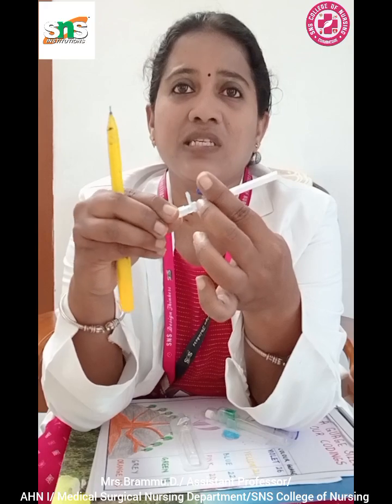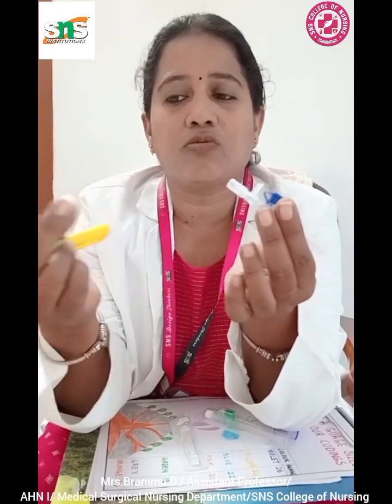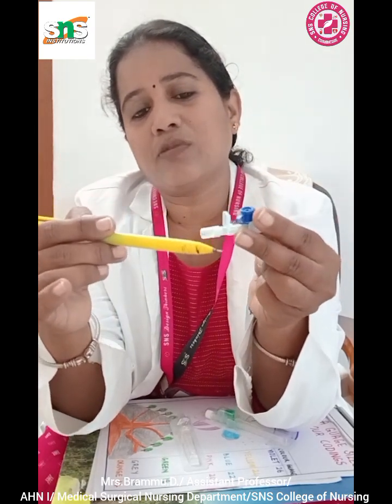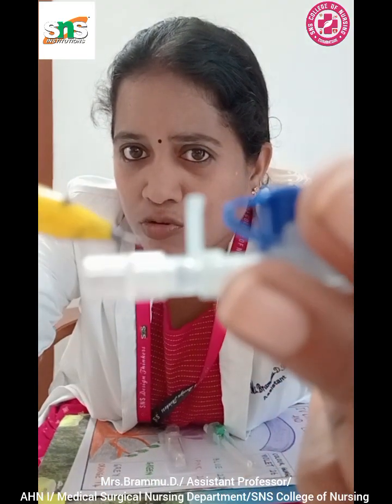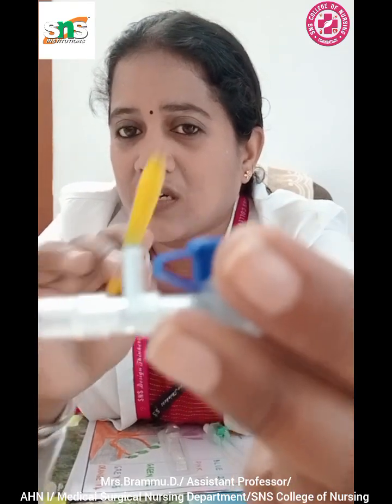Next we can see the flashback chamber. I would like to hold the luer lock plug in my hand. This is the flashback chamber, very close or next to the luer lock plug. This portion is your flashback chamber. Here you can see a needle as well, very close, and there is a small portion where, as soon as the cannula has entered the vein, there is an immediate flashback phenomenon.